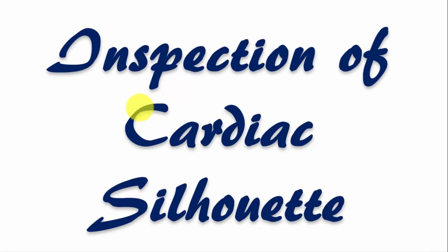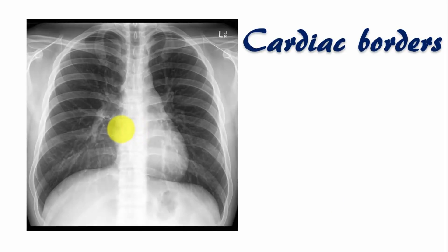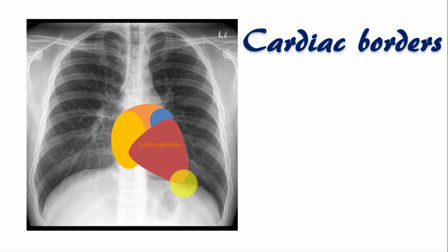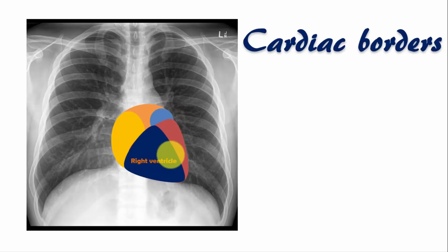After inspecting the lung fields, inspect the cardiac silhouette. The posteriormost part of the heart is formed by the left atrium. Usually the left atrium doesn't form any borders in the chest X-ray, but a small part called the left atrial appendage or left auricle forms a little of the left border. The right atrium fully forms the right border of the heart. The majority of the left border is formed by the left ventricle, with a small part by the left auricle.